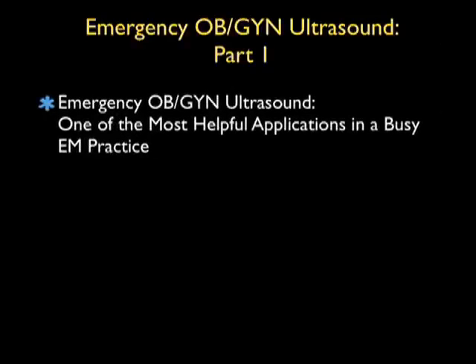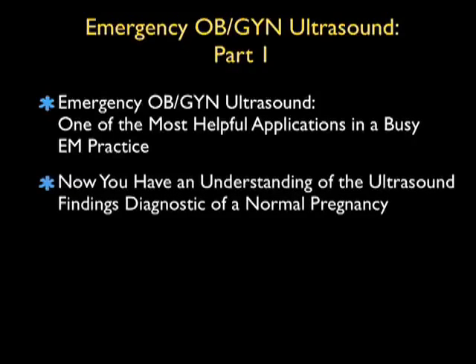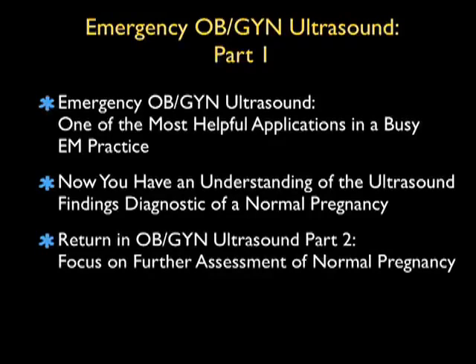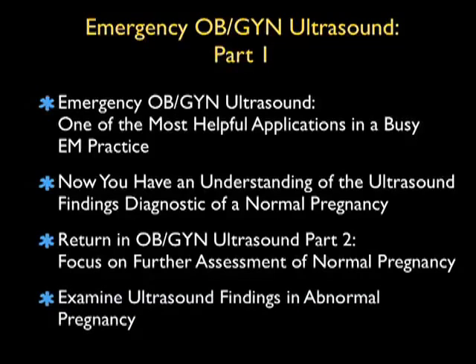So in conclusion, I'm glad I could share with you this Sound Bites module going over emergency OBGYN ultrasound, part 1 of intrauterine pregnancy. Emergency OBGYN ultrasound is definitely one of the most helpful sonographic applications in a busy emergency medicine practice, and hopefully by going through the module you now have an understanding of the ultrasound findings diagnostic of a normal pregnancy. I hope to see you back as we return in OBGYN ultrasound Pregnancy Part 2, focusing on further assessment of normal pregnancy as well as looking further into the ultrasound findings of an abnormal pregnancy.